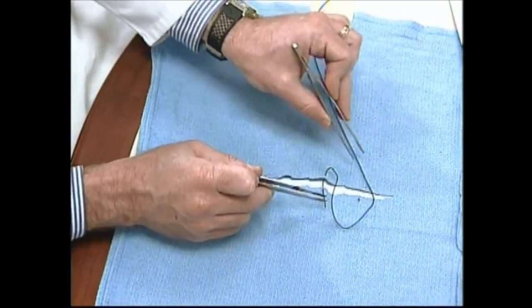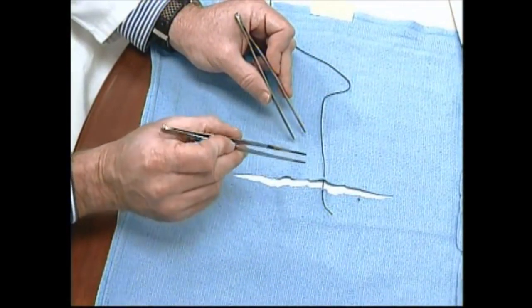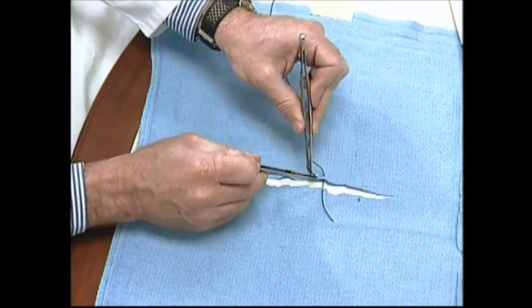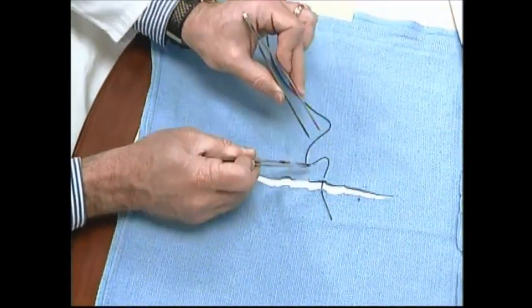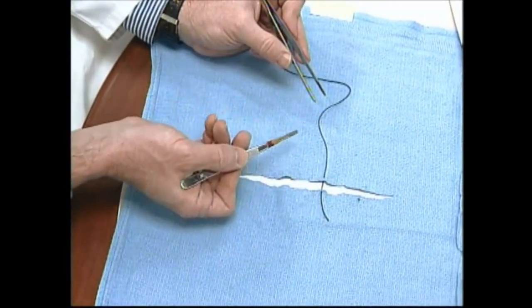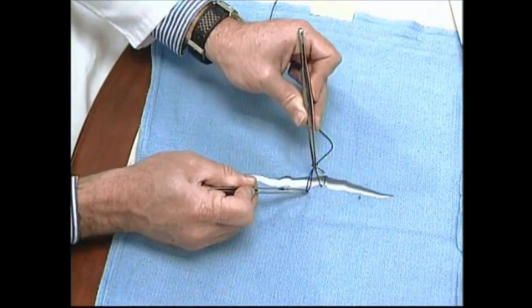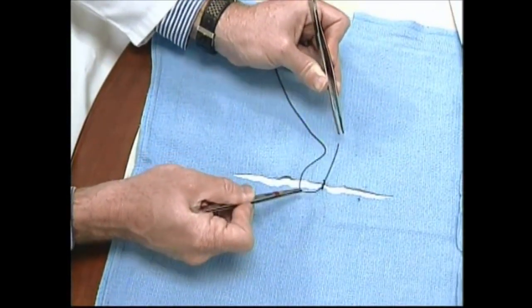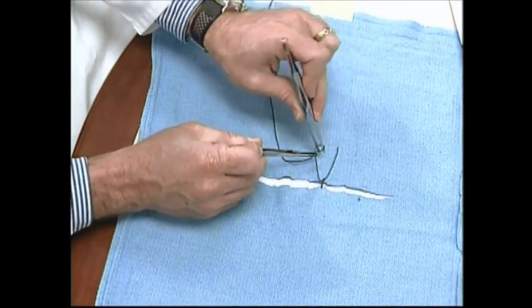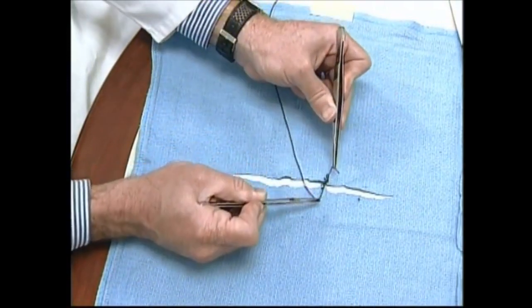When using the needle holder, an alternate method of making the loop is required. What I usually do is grasp the suture end with the right hand and make the loop with the right hand, grasping with the left hand which holds a fine forceps. We grasp the suture with the hand palm up or supinated, make the loop, wrap it around the left hand instrument, and pass the square knot. After this we don't need to let go — we continue making the loops in a mirror image fashion: grasp, cross the hands, and the third knot throw is made.